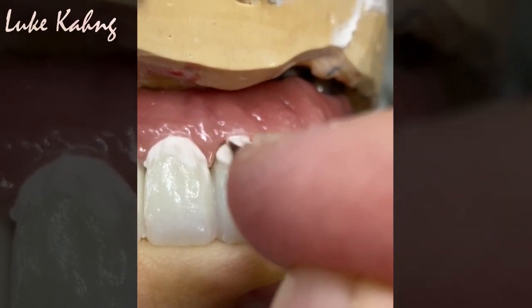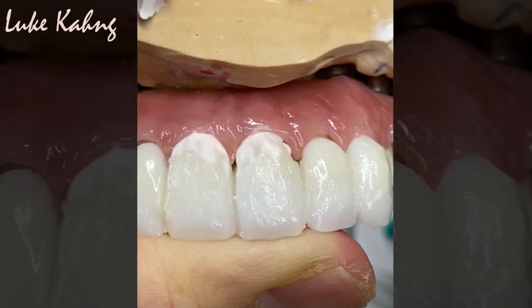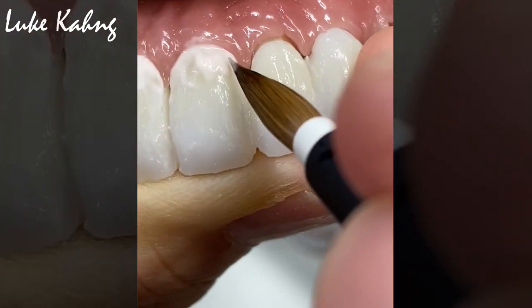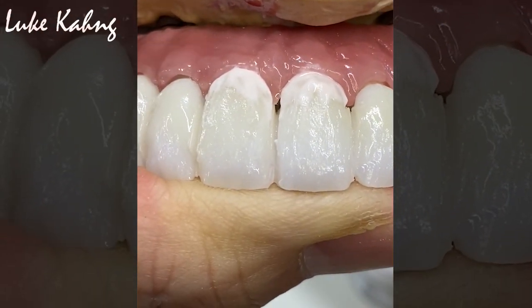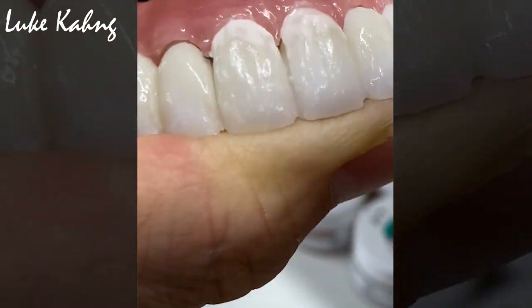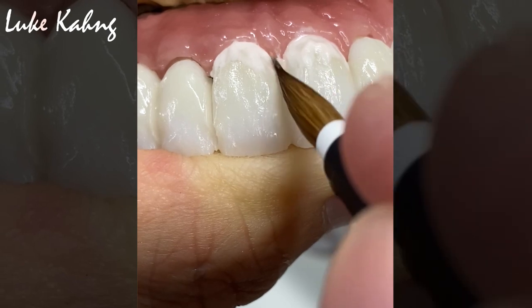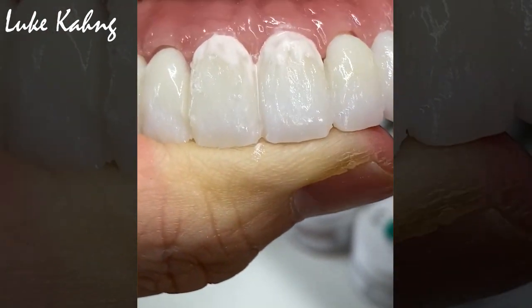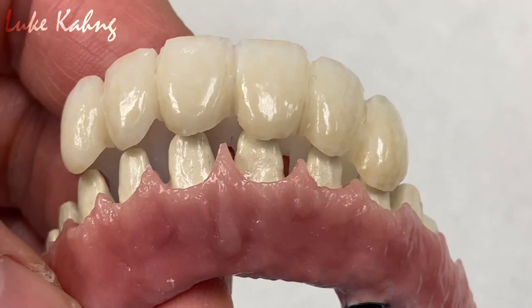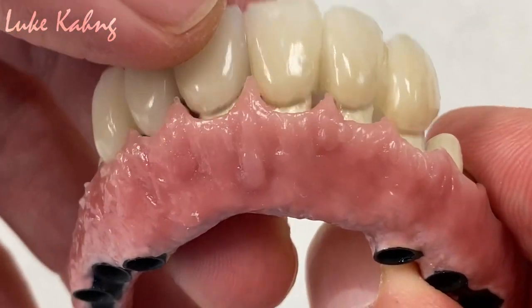We almost get to the final, but before we do that I have to put some separator inside. Then I can get the maximum margin line with tissue. Then I can recreate the other contour — just like that. After firing the porcelain, just one more time to get great adaptation.